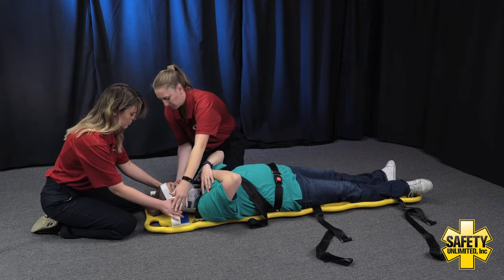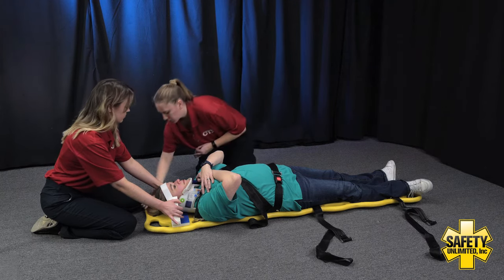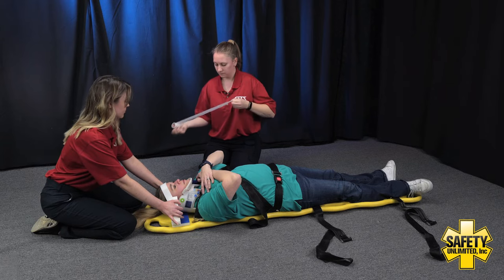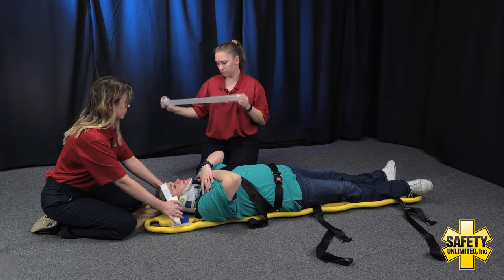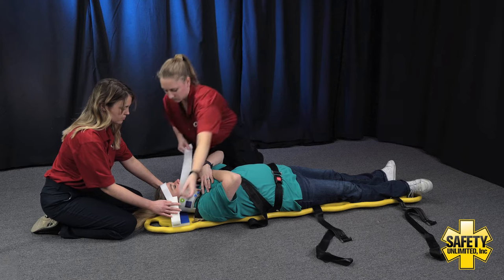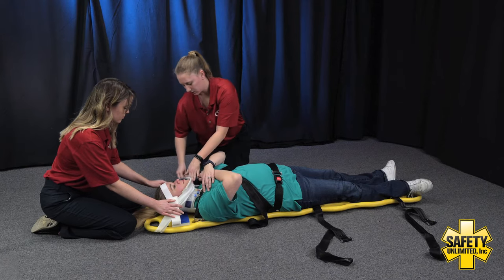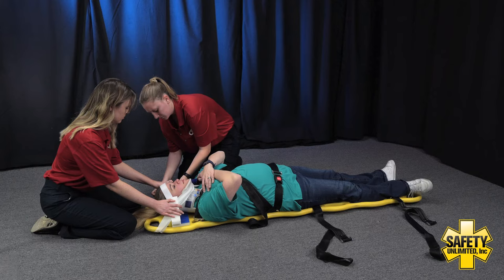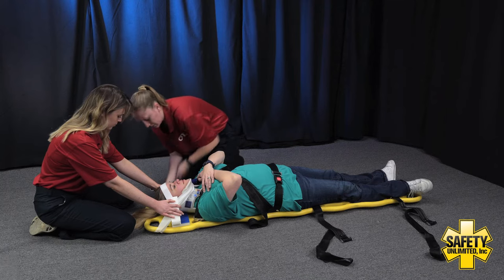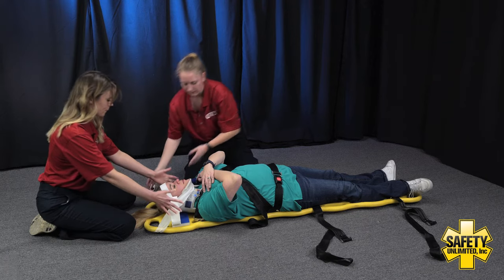Go ahead and replace your hands with mine and hold on those blocks again. Now we're going to take our two inch tape and go up underneath the chin to the top portion of the board. Go ahead and remove your hand. I'm going to go up under the chin here and tape it to the other end of the board. My EMT assistant can now go ahead and let go of the manual stabilization. Now that the head is fully secured, we're going to go down to the legs.